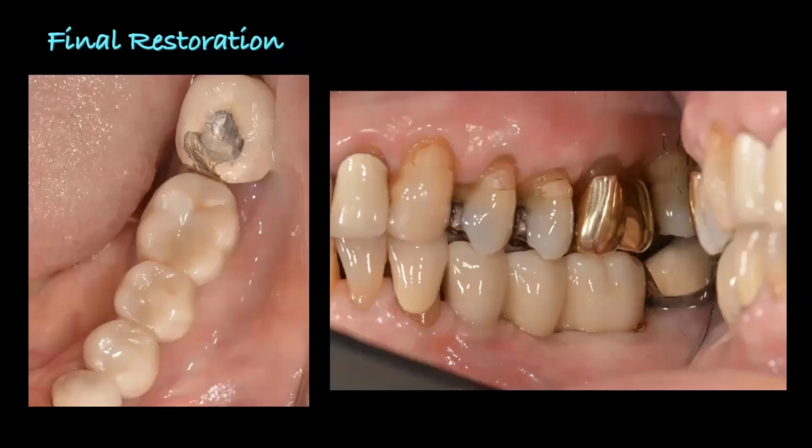And that is something that we have definitely seen over the years in our clinics. Because we are mandatory when it comes to cone beam CT technology and we utilize it for every patient, it allows us to be very predictable in how we go about our cases, but also very predictable in what we can attain, and we can double and triple check our work. But also, like I said before, the biggest thing is it sells us cases. When it comes to talking to our patients and saying, hey, listen, this is your mouth, you're missing these teeth, these are the areas, these teeth are tipped, and so on and so forth.